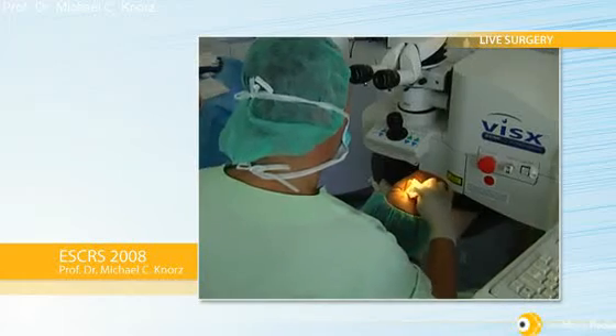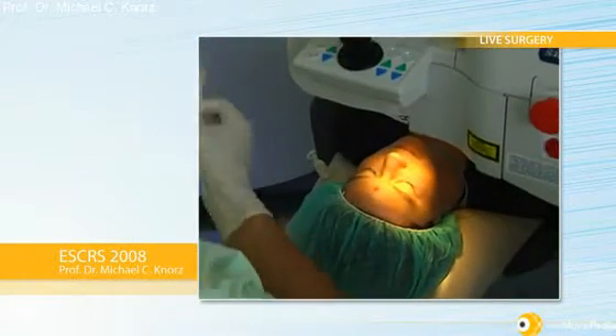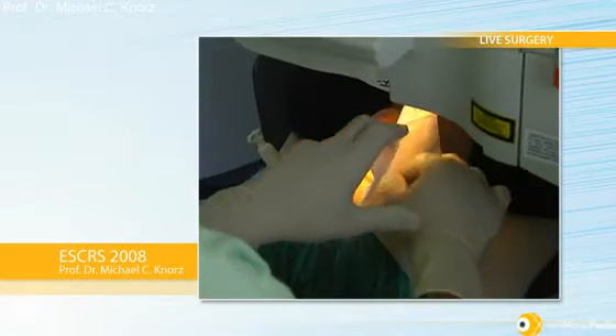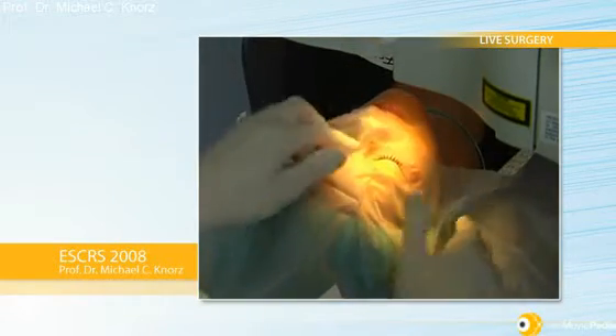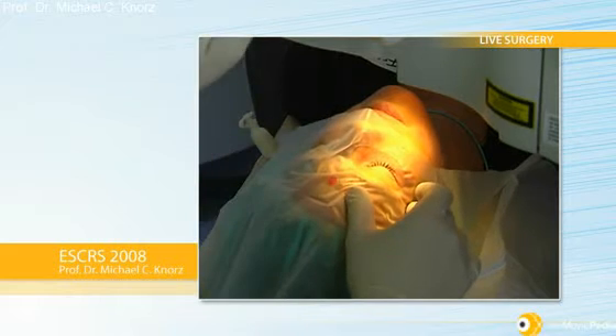I will start by drying the skin around the eye, then I will place an adhesive drape which fits around the eye to keep everything sterile. I reposition the patient's head.